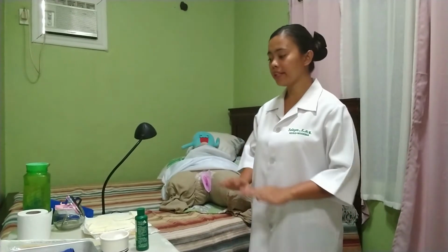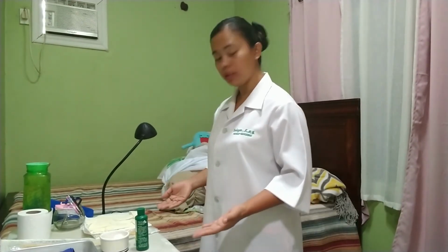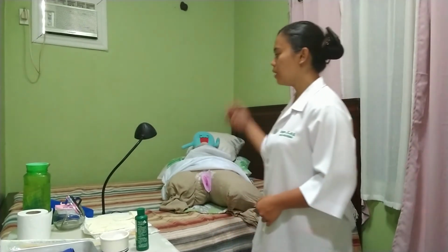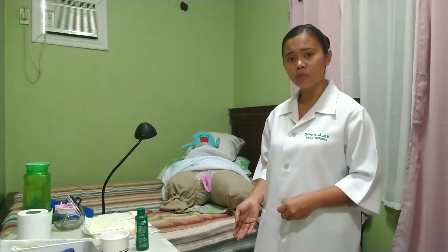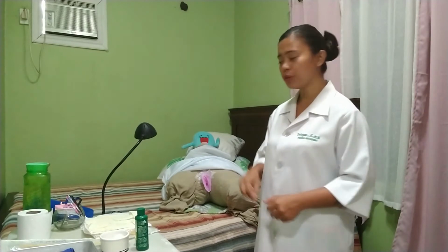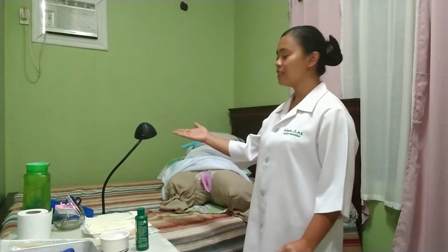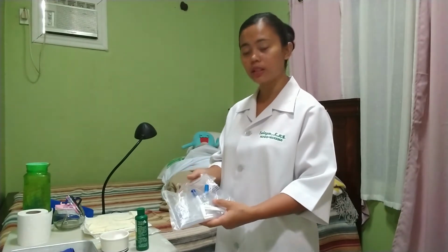Then we have to organize our work area. We have to arrange our bedside table, position the plastic bag or the trash bin, and as well as position our procedure light. Positioning our plastic bag right here or trash bin will allow us to protect our sterile field, so we won't have to reach over and contaminate our sterile field. The light is very important in visualizing the meatus later on. If you're using a collection bag, we have to open the bag and place the end of the tubing within reach.